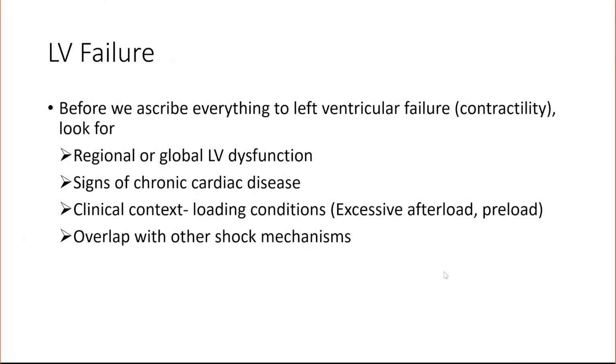Okay, there is another pitfall, and this is more important for an intensivist. Echo is sort of a portrait at one time, but point of care echo is something that you do repeatedly, and we are also aware of the whole patient and not just the function as you assess it on the echo.